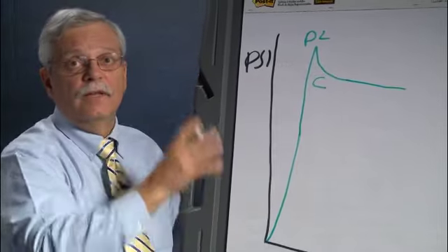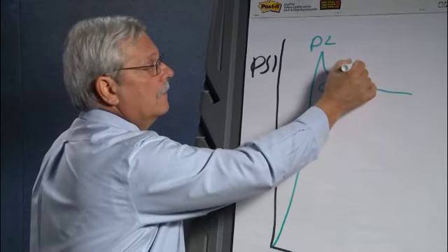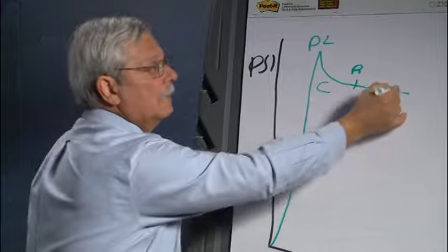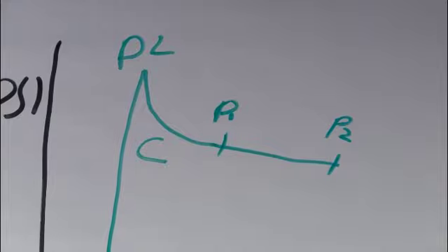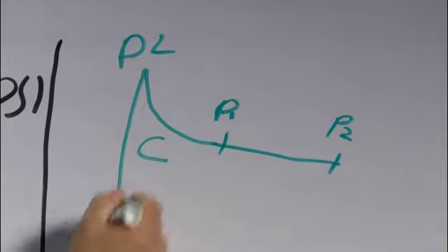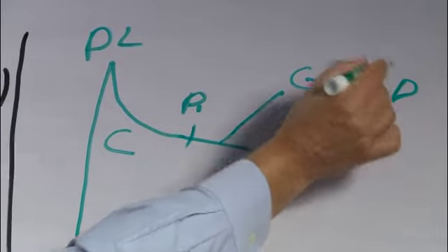After it reaches the pressure limit and the machine allows for the compliance time, it takes a reading, P1. A little while later, it takes a reading, P2. It subtracts P2 from P1 and calculates a leak rate. This is what we expect to see from a good system.